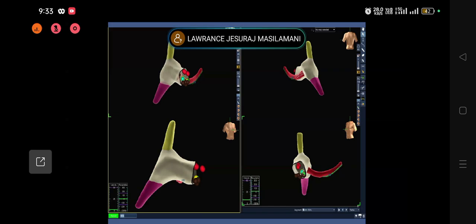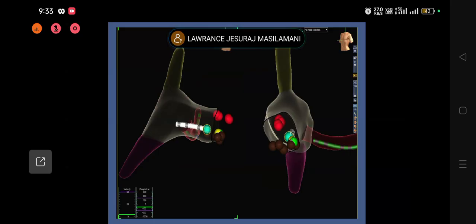You can see in this patient I have gone a little cephalad. I moved a little up, went a little high, because this was a very difficult AV nodal ablation. I started at a lower dose and went a little up, which is not the case in most cases. You can see very clearly where my catheter is, and this is the proper location.